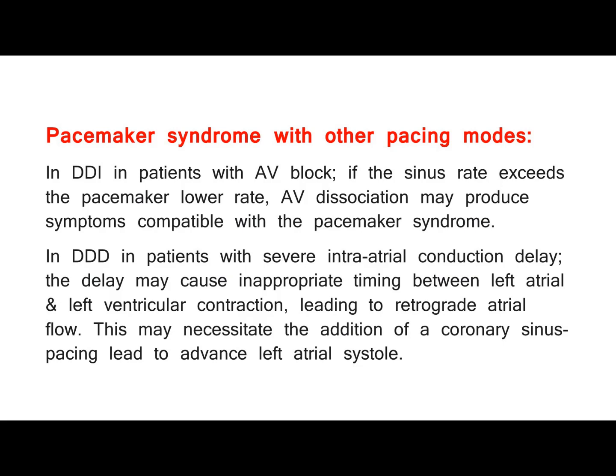In DDD in patients with severe intra-atrial conduction delay, the delay may cause inappropriate timing between left atrial and left ventricular contraction, leading to retrograde atrial flow. This may necessitate the addition of a coronary sinus pacing lead to advance left atrial systole.